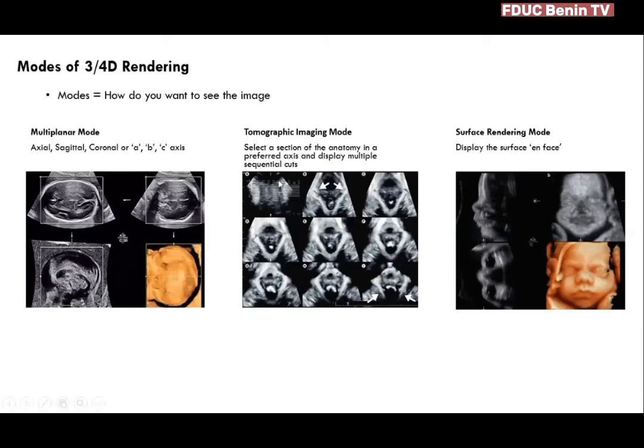Now the ROI starts from the top up here all the way down, and so what the operator intends to do, or is asking the machine, is: I have identified this region of interest, can you give me multiple tomo slices across this region of interest and display them for me? So once the operator has set this on the machine, the reconstruction algorithm renders these images automatically. And you can see the anatomical variation on each image plane as we progress superior-inferiorly.